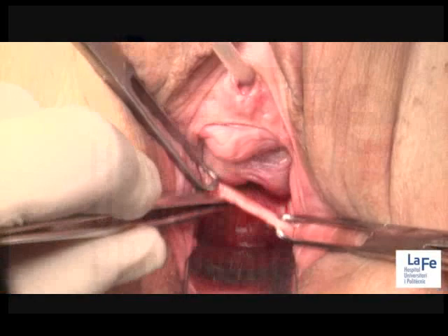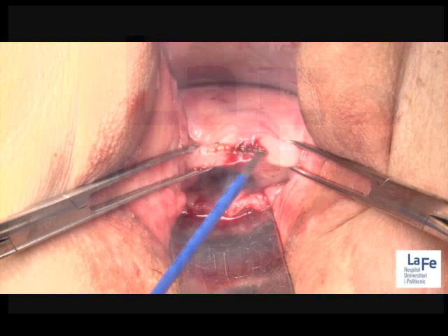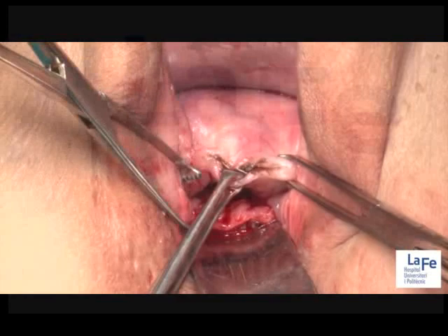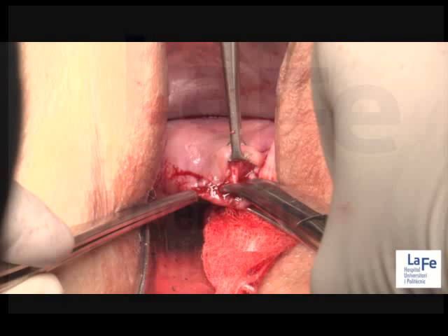The incision is made through the full thickness of the vaginal epithelium. Adequate counter traction against the respective lateral vaginal wall by the assistant is needed. The vagina may be dissected sharply with scissors from the underlying tissue, or this may be accomplished with gentle blunt dissection.